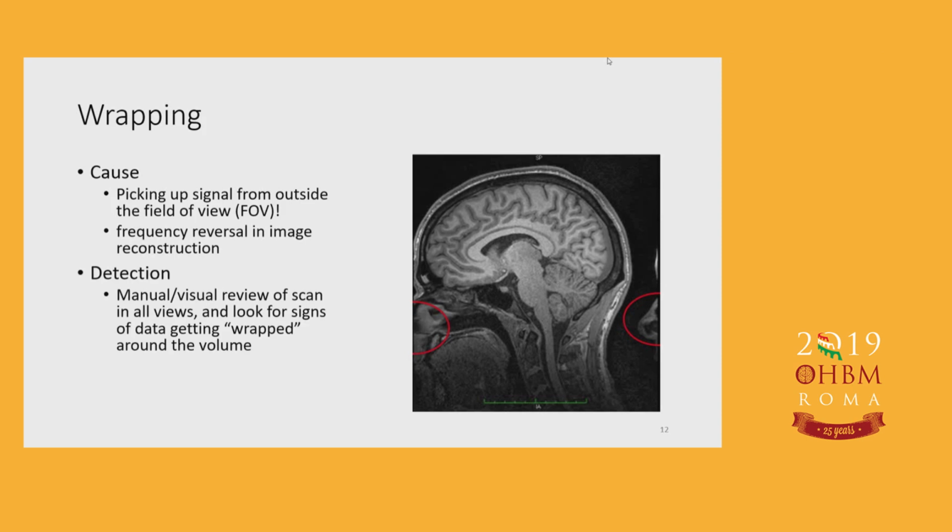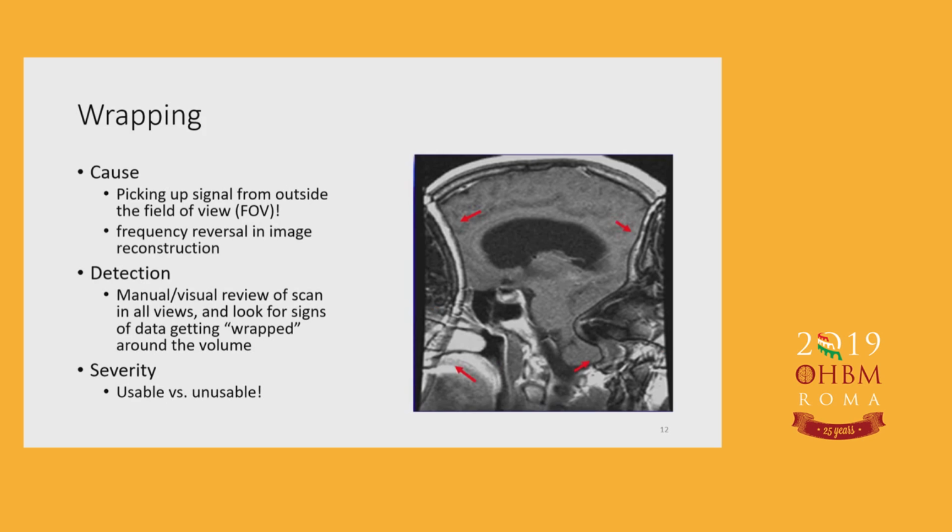You can easily detect it by visual review of the image, and typically it's either usable or not usable depending on how much and where it's getting wrapped. For example, this I think is not usable for analysis.